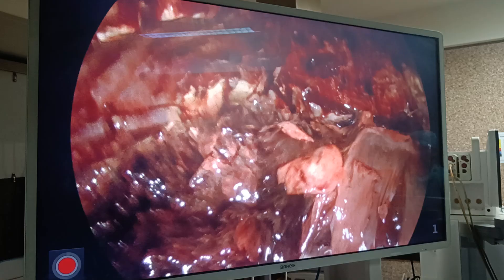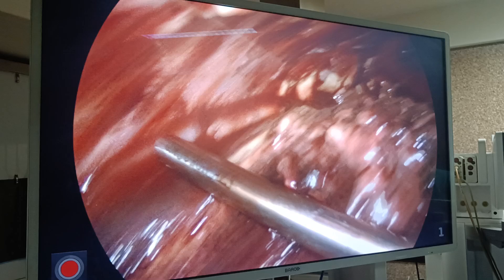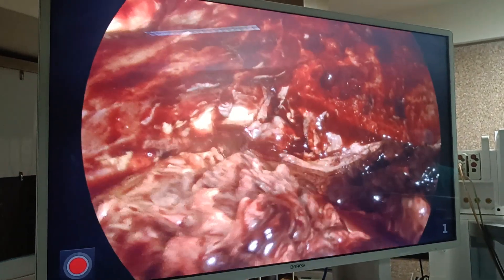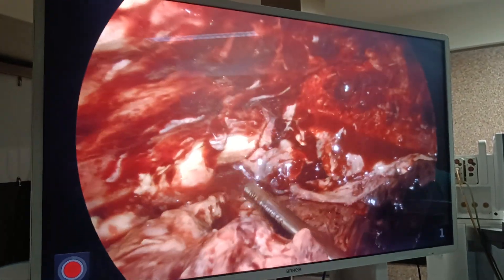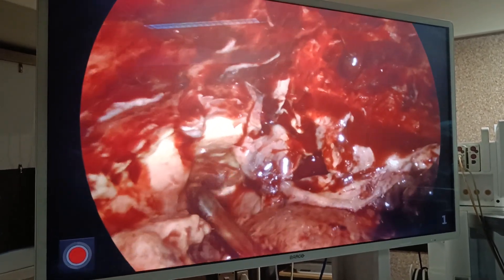We just close it. We had opened the first cavity here. See here, I am going to put a big drain here. See — this is all dirty material coming out. Can you appreciate this? This is all for safety.